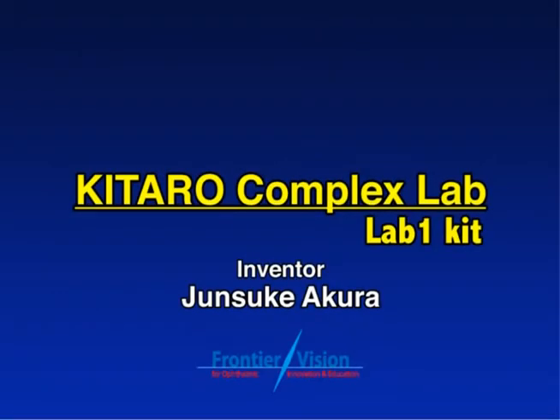This is a film which explains how to use Kitaro Complex Lab. Kitaro Complex Lab is the tool for intermediate surgeons to practice many kinds of complex cases in cataract surgery.